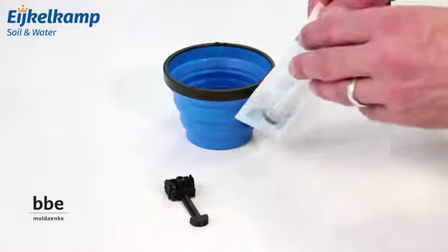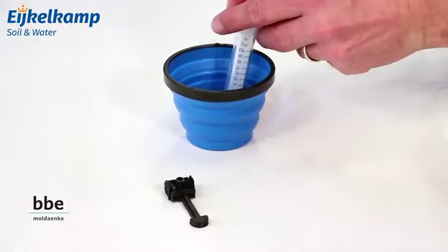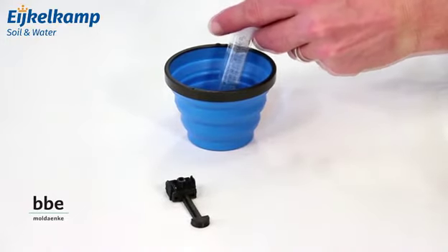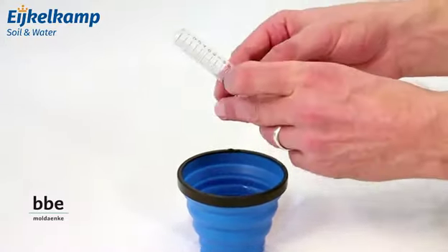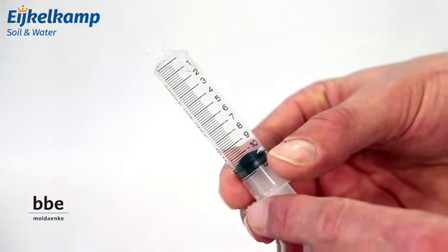Using the syringe, take a 10 milliliter sample from the cup. Additionally, leave one milliliter of air to avoid dead volume during the filtering.